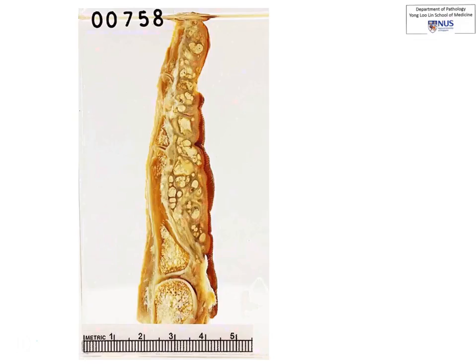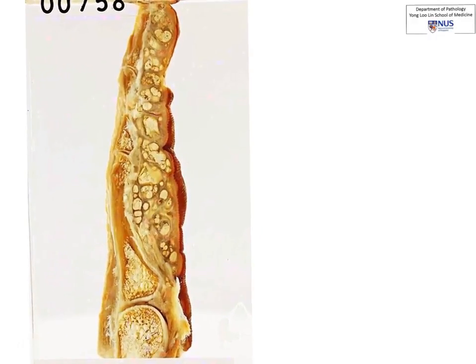Now let's take a closer look at what is actually happening. If you pay attention to the soft tissues, particularly here in the palmar aspect of the finger, you can see that there are lots of these irregular, well-defined, chalky, whitish deposits. And in fact, some of them are actually encroaching upon the bones of the phalanges, as you can see.